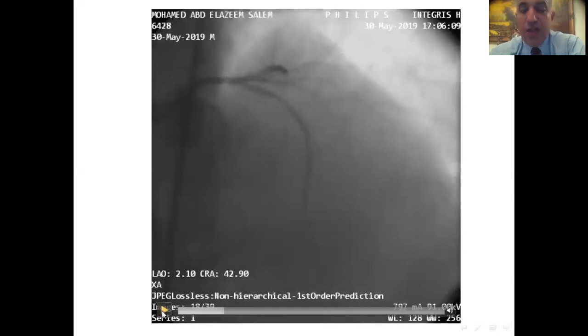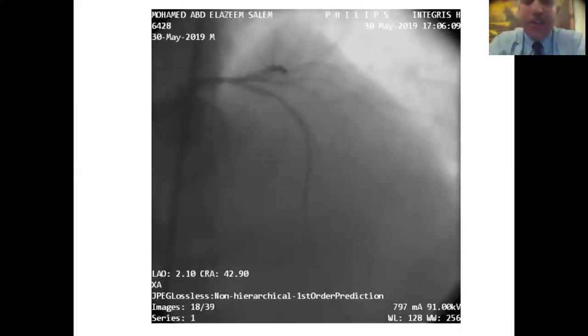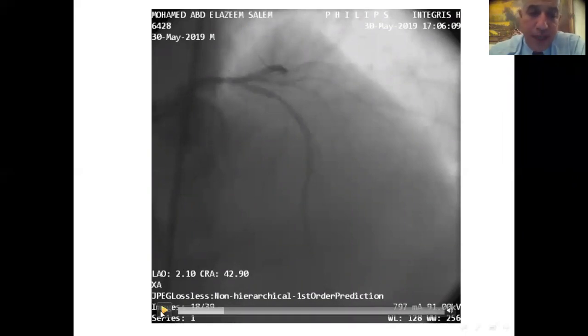The decision here, because the patient is electrically unstable and he is NSTEMI, and we have to do something for him immediately, is to proceed with intervention. And of course, we will proceed with a bifurcation technique because here we have involvement of the ostial circ and the proximal to mid segment of the LAD. Of course, 2 wires are pushed in the LAD and the LCX.